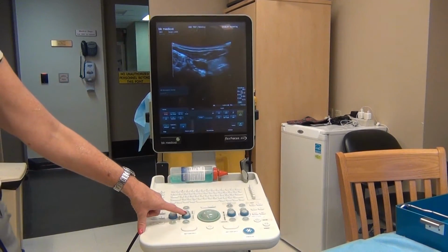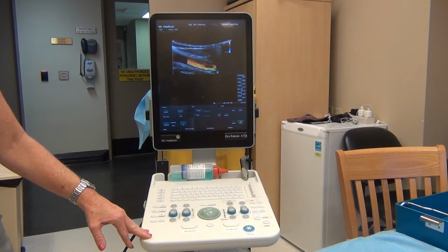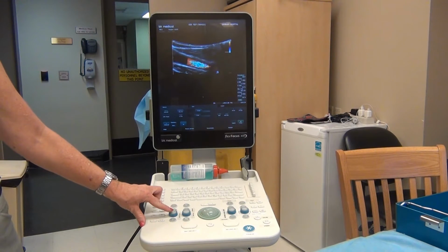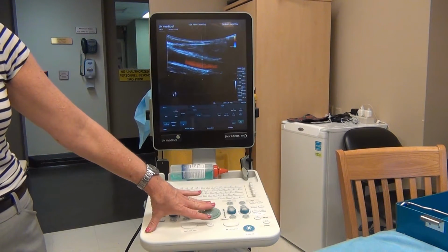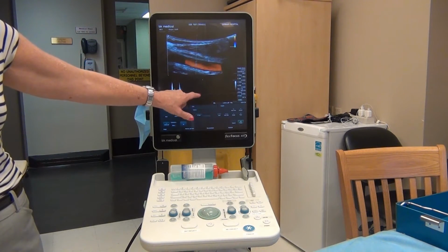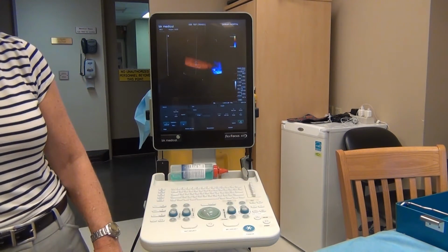Okay. Say we were in color, and I'm going to look at my carotid here. I'm not sure if they will be doing any Doppler analysis. If you want to get a Doppler or a spectral analysis, I'm going to hit D for Doppler. I'm going to move and put this D, and I'm going to hit that auto button.